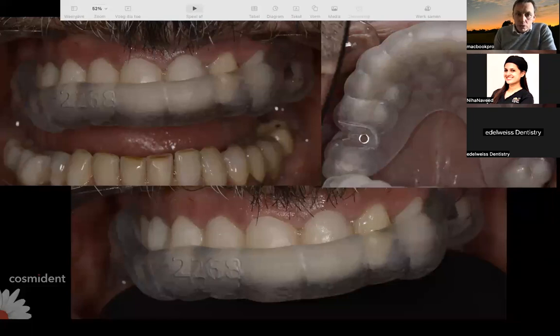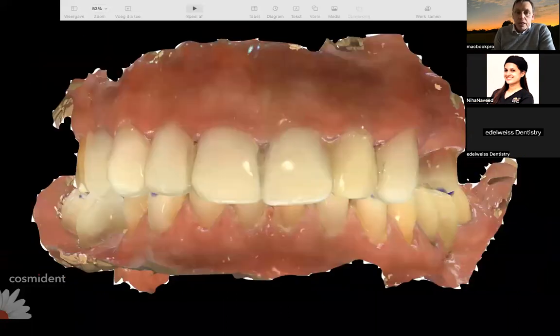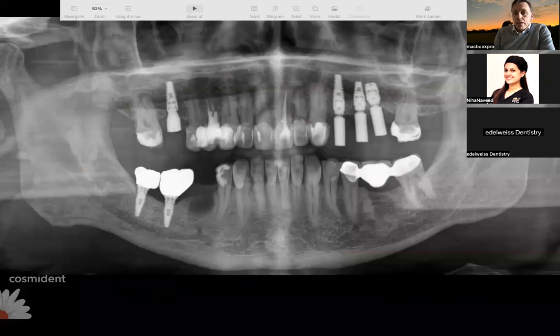Here you see the guides which we used. We simply used a pilot guide at that moment to direct me in the right position. The patient came in, and we did always the same workflow: an intraoral scanning, then based on it a CBCT scan, and placed everything together. Finally, we placed the implants. You see here the 4 implants placed, upper 1-6, and then 2-4, 2-5, 2-6.